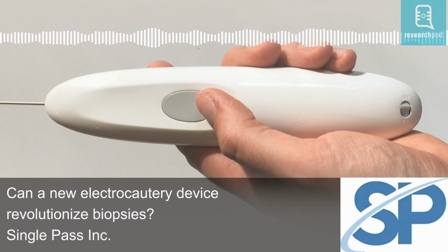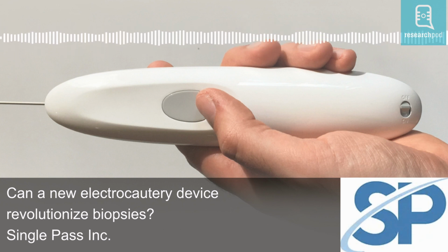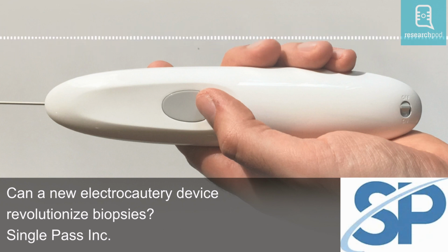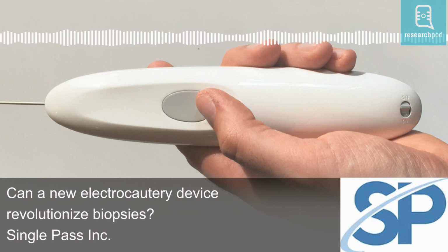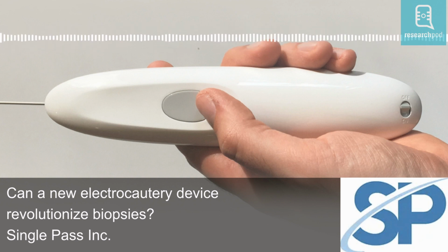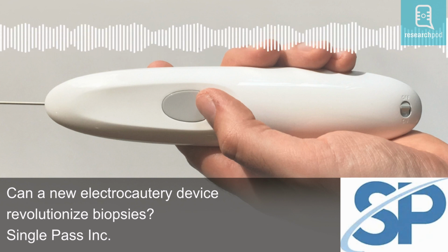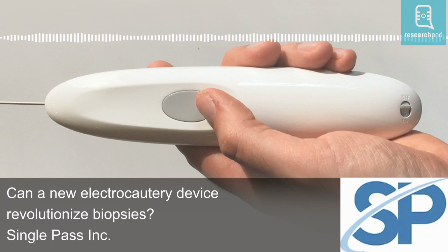The most recent study, started in 2022 and finishing in early 2023, assessed the safety of the single-pass electrocautery device on organs, including liver, kidney, lung, breast, and other soft tissue biopsy procedures. Patients with known bleeding disorders were excluded from the study, along with anyone who had a medical condition that could interfere with results. In total, 60 participants were analyzed. Success was measured in 5 ways.